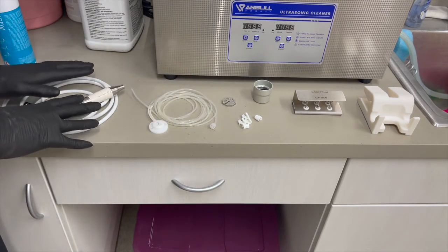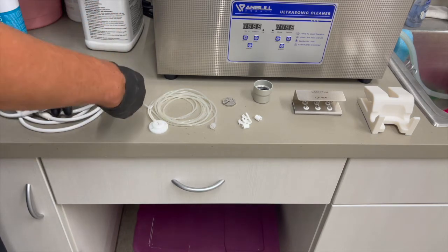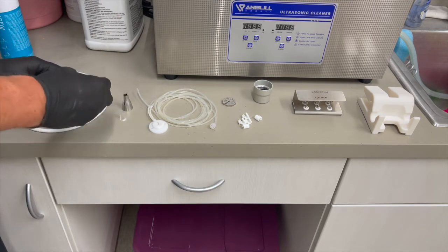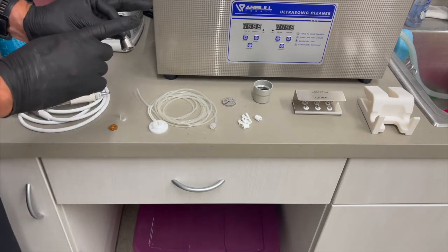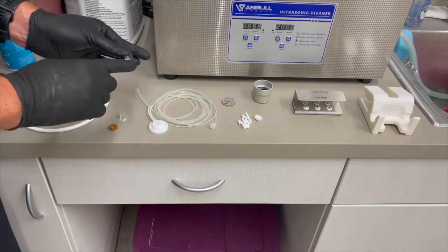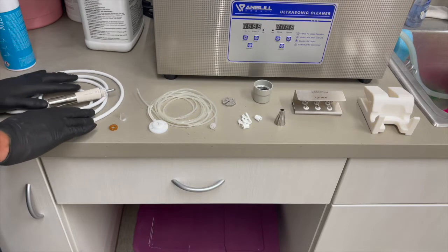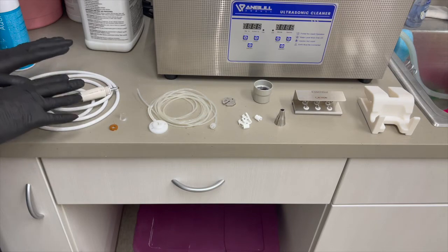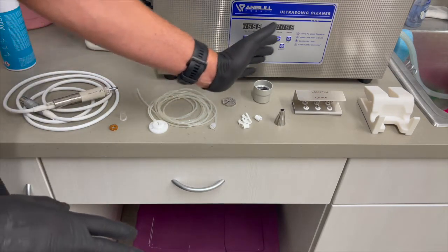We'll clean the handpiece by hand. Take the handpiece and unscrew the nose cone. You'll have your nose cone, and under that you'll have your light guide, and under that you'll have your LED light ring. The nose cone can go into the ultrasonic or an instrument washer. The light guide and LED light ring we do not want to submerge, so we're not putting those into an ultrasonic or instrument washer — we're going to wash those by hand.